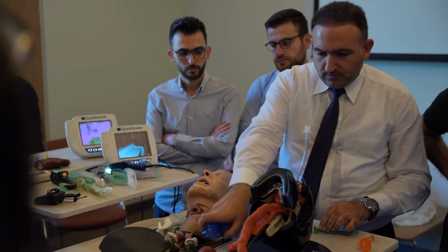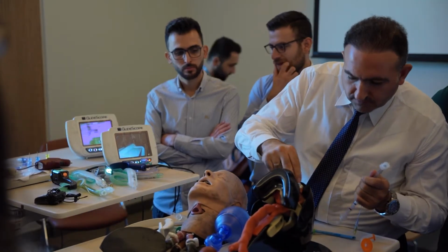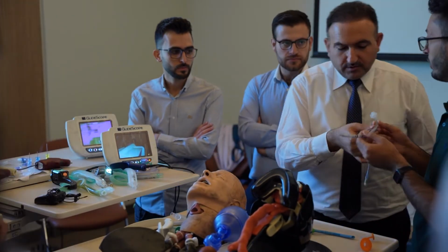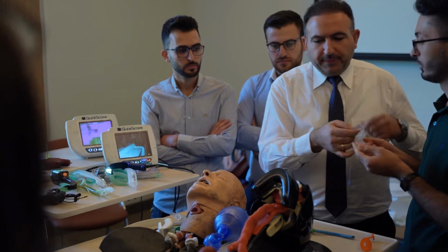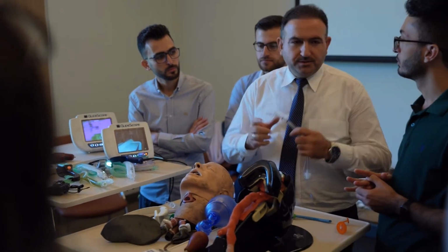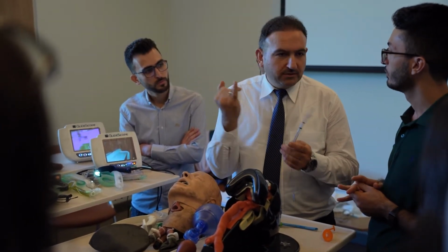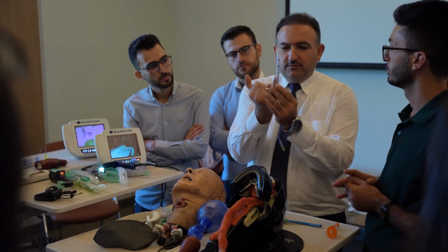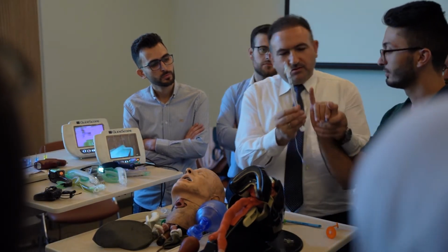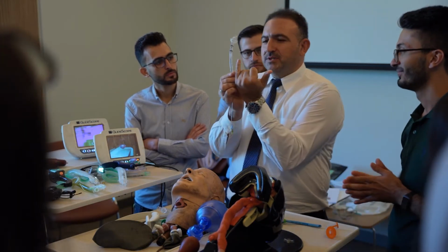So I think most of you did this before. I have a question about selecting the size of the endotracheal tube. How do we know this is the proper size for the patient? There is an equation, but it takes time. So roughly speaking, use the patient's little finger and compare it with the tube. For example, this is small for my size but fit for his size. It's the same size as the little finger.